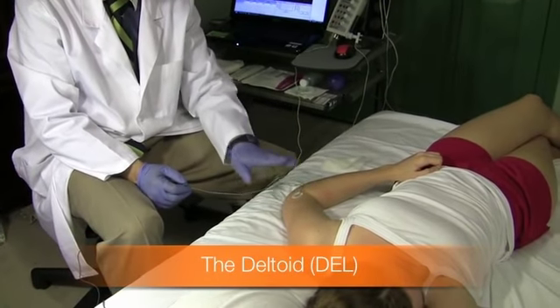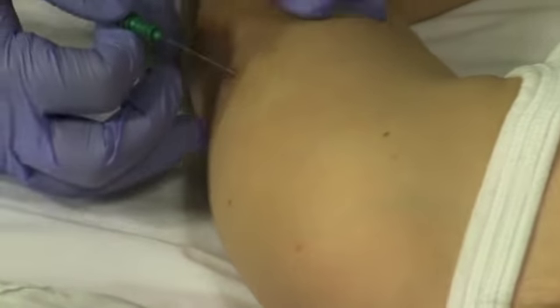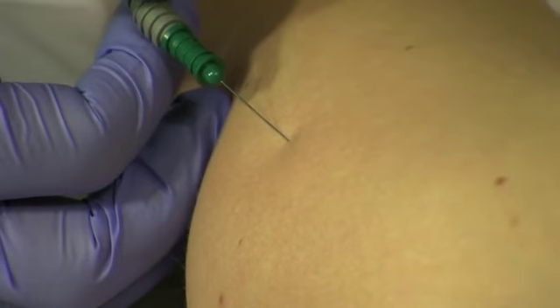Well, the last muscle in the upper extremity is the deltoid. I'm not including the paraspinals yet, but the last muscle in the upper extremity is the deltoid. The deltoid is right here. It's innervated by the axillary nerve, and it's C5-6 innervated. Here we go. Stick. That's it.